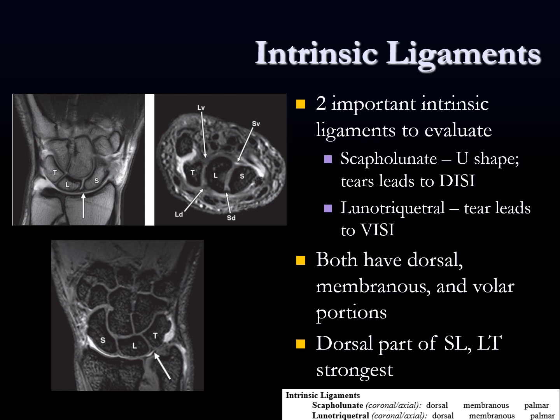Usually on the coronal images there are some nice little black triangles you can find, especially on better quality or 3T magnet studies, which is the best technique for looking at those structures. The scapholunate ligament is an important stabilizer — scaphoid-lunate tears give you DISI deformity. If the scapholunate ligament is torn, it will tend to let the lunate dorsally rotate, giving you a widened scapholunate angle — dorsal intercalated segment instability. Disruption of the lunotriquetral ligament would more likely lead to VISI — volar intercalated segment instability.